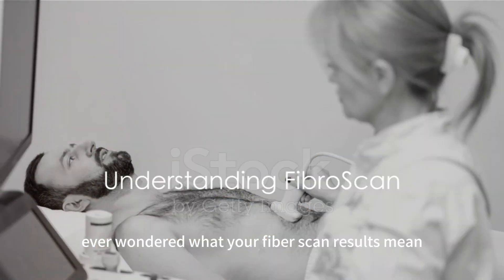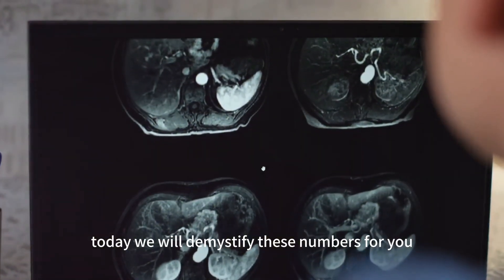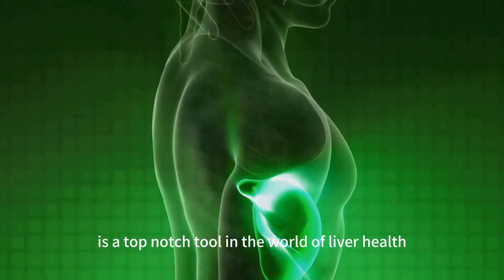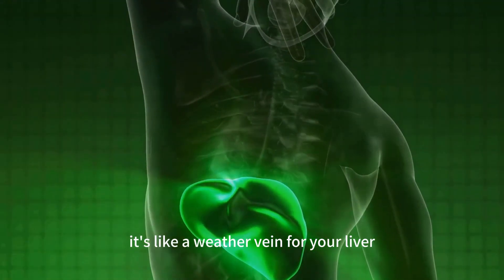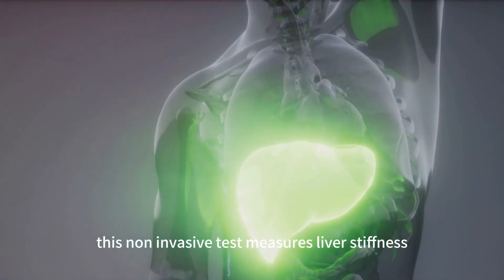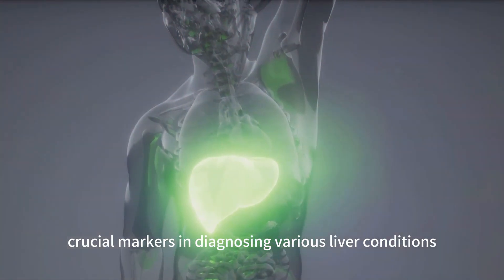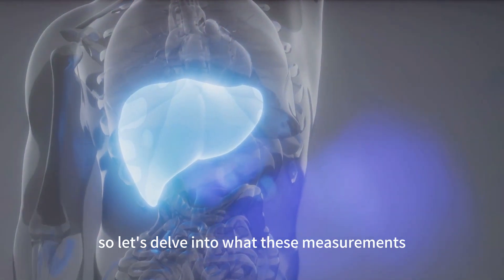Ever wondered what your FibroScan results mean? Today, we will demystify these numbers for you. FibroScan, also known as transient elastography, is a top-notch tool in the world of liver health. It's like a weather vane for your liver, providing a snapshot of the organ's condition. This non-invasive test measures liver stiffness and fat accumulation, two crucial markers in diagnosing various liver conditions. So, let's delve into what these measurements mean.